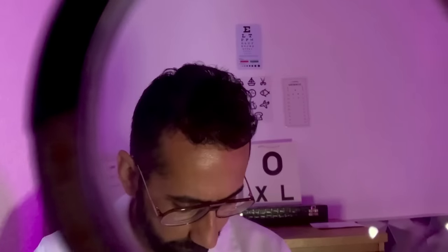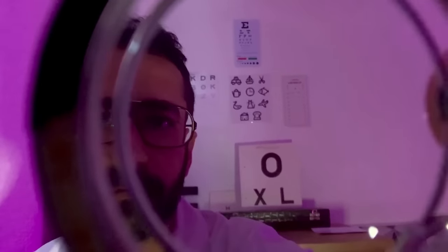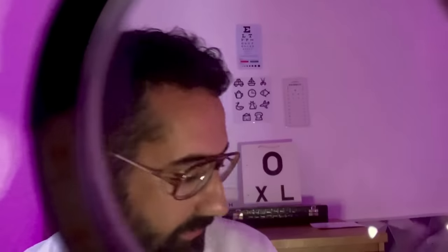Let's just record the results this far. Good. Just want to double check that we are in the correct area in terms of the prescription. As you're looking straight ahead again, are things a little bit more blurred with the lens compared to without? A little bit worse with the lens — okay, just double checking. That's a little bit more blurry too — excellent. So it looks as if we have the correct sphere in place there.